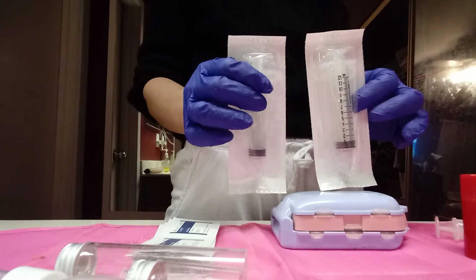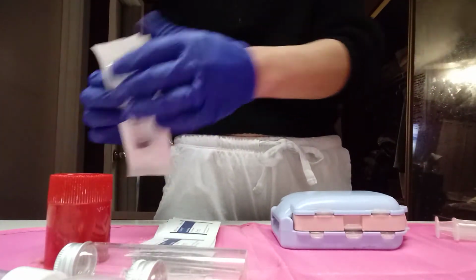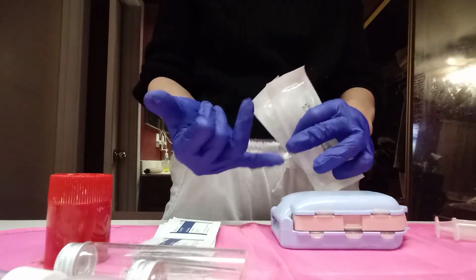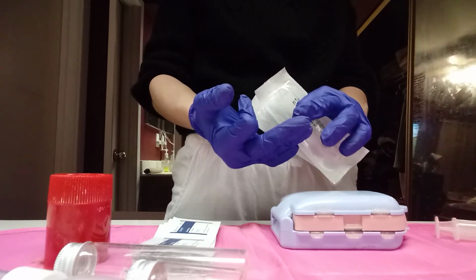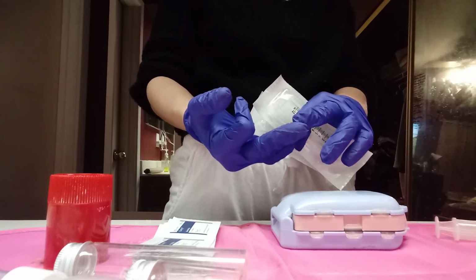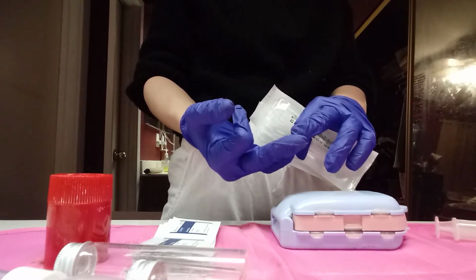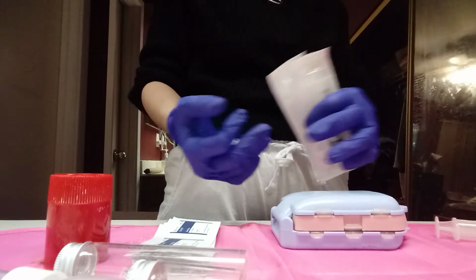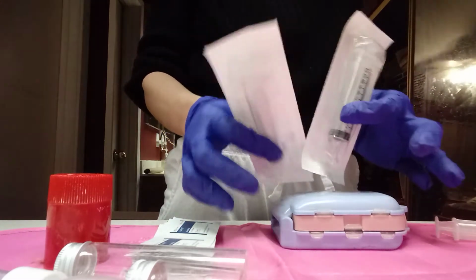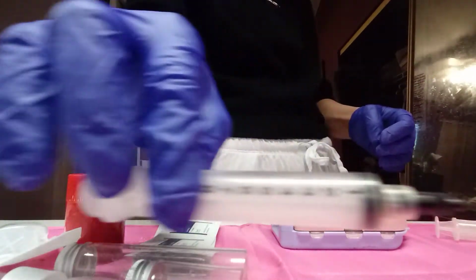More important is to have these. So what I do is I bring my crusher with me. Okay, so far you've got your extension set, you've got your 10cc syringe with a cap, you have several options to pre-crush and fill and bring those with you, and just pour them into the 10cc, flush the 10cc 3 times. That's what I do. It works great. Okay, make sure you have these. Okay, and then we discussed blunt tip caps.